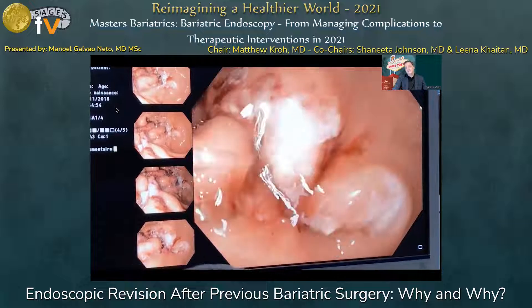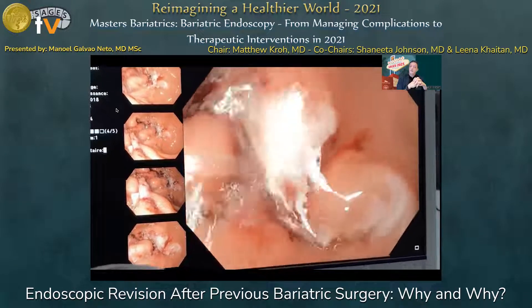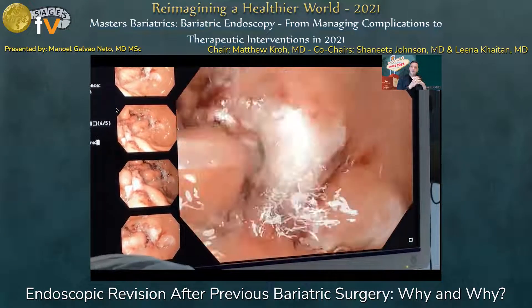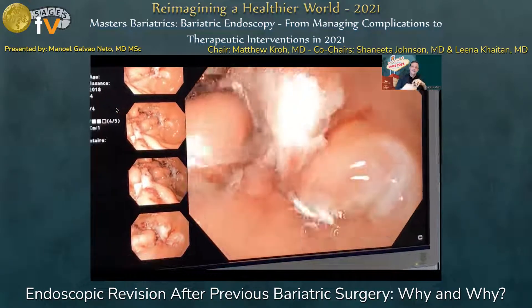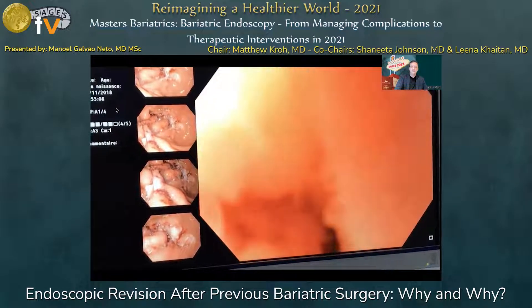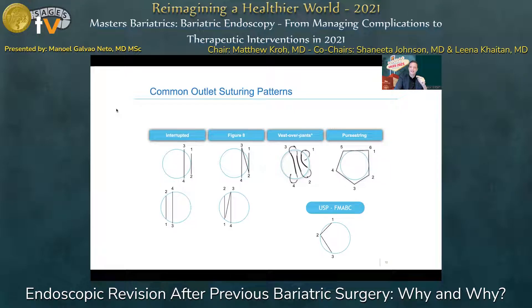We can see here that we can remodel at will. We have data suggesting we need to go beyond 10 millimeters, as you can see in the images following the remodeling. We have quite a few suture patterns available. There is not hard evidence, but some evidence that the purse-string pattern may have more durability — though this still needs to be proved.